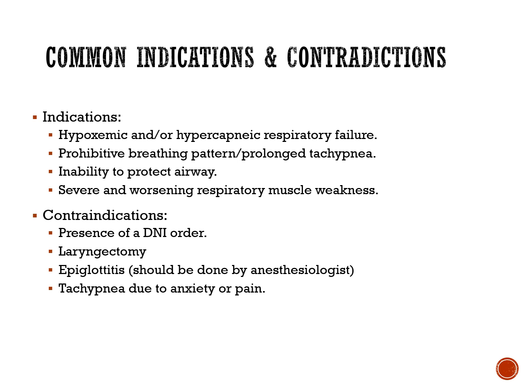Some contraindications would be the presence of a DNI, or a do not intubate order. A laryngectomy. In fact, what we do with our laryngectomy patients, in addition to doing all the things that I mentioned in my introductory slide, I still work adult acute care at a major trauma center in north central New Jersey. And we, in fact, get patients that have laryngectomies. Our protocol is also to put a sign in a very prominent spot in the room that basically says do not intubate, because the patient does not have a patency between their mouth, if you will, and their lower airway.